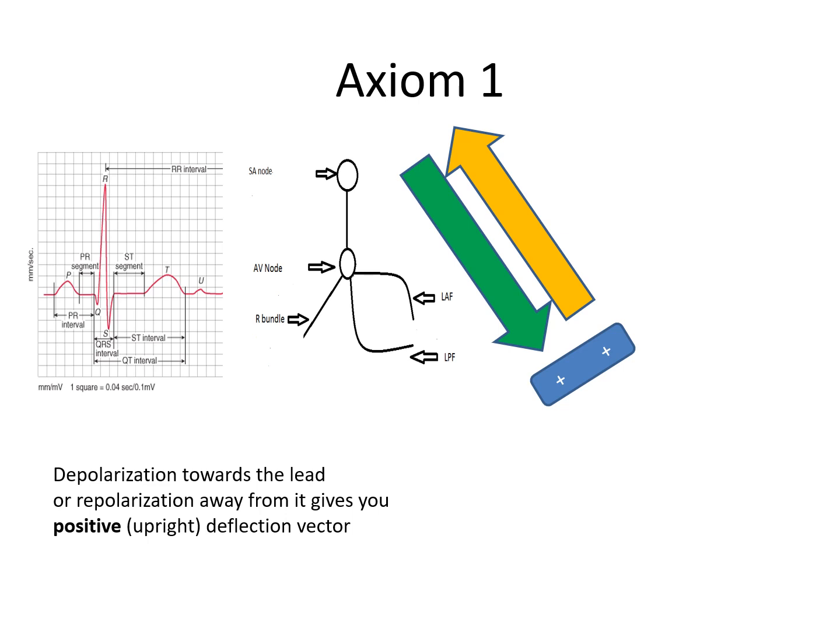The practical result of this is that for a functioning His-Purkinje system, you will have a very fast depolarization, much faster than the refractory period of a myocyte, almost instantaneous. And then you will have a slow repolarization cell to cell in exactly the opposite direction. So depolarization from top of the heart towards the bottom, and then repolarization from the bottom upwards. Because both the directions and the signs of those two phenomena are opposite, they will both produce positive deflections on the ECG. So usually the QRS and the ST segment are what we call concordant, which is to say they point in the same direction.